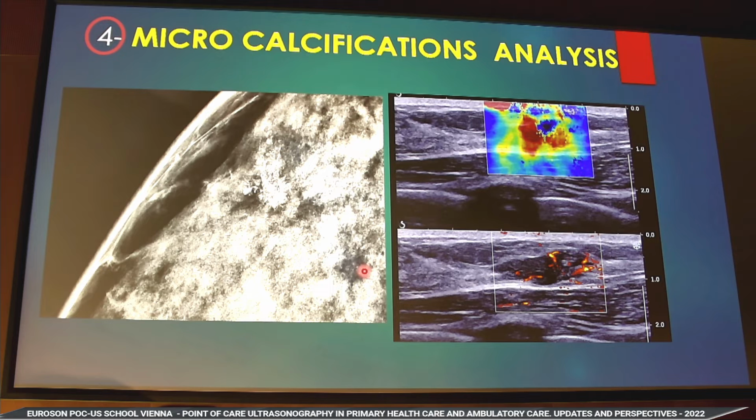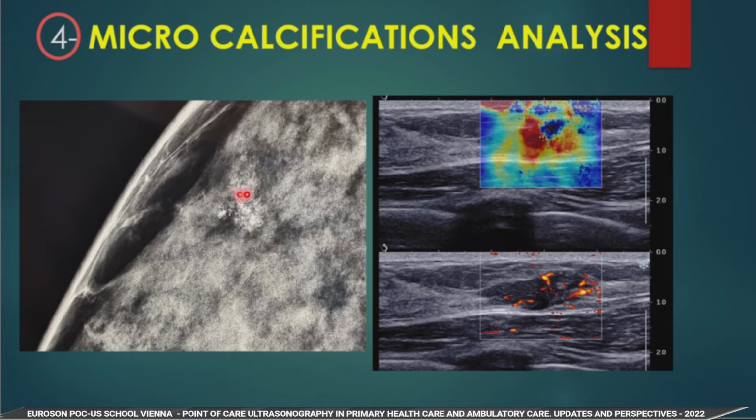In case of microcalcification, they are not specific. Sometimes you have very, very small microcalcifications. How can you know if it's something with a carcinoma? In some rare cases of diffuse no-mass cancer, you use elastography, and you have a really good answer.